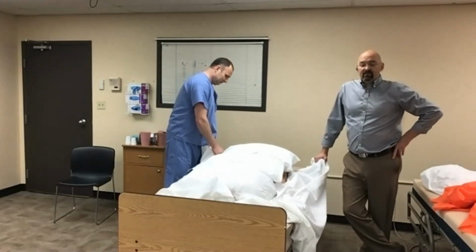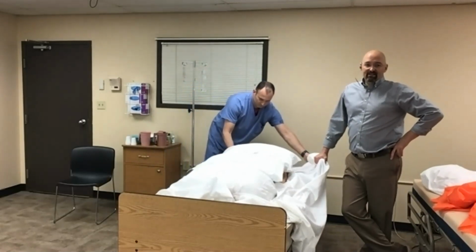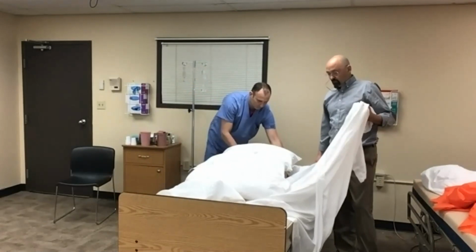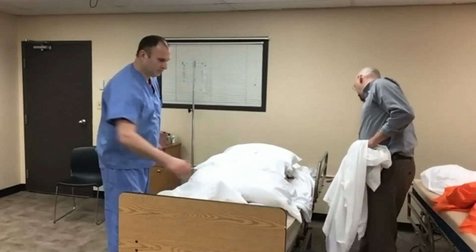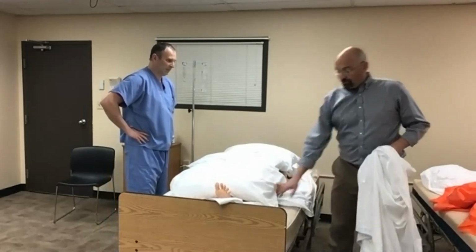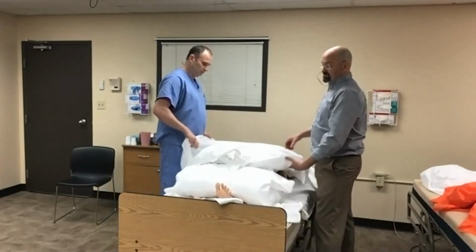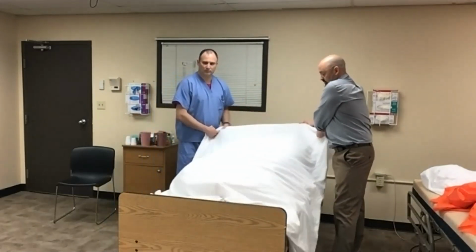The last technique is doing something very similar to that, except we're going to eliminate the use of the slide sheets. Now, I will tell you, having done this previously now a number of times with a full person, i.e. Mark, the amount of force it takes to physically prone a patient is substantial. A lot of people are doing this technique just because they don't have another option. So we're showing it. But when it comes to safety for your caregivers and safety for your patients, this is the last resort.